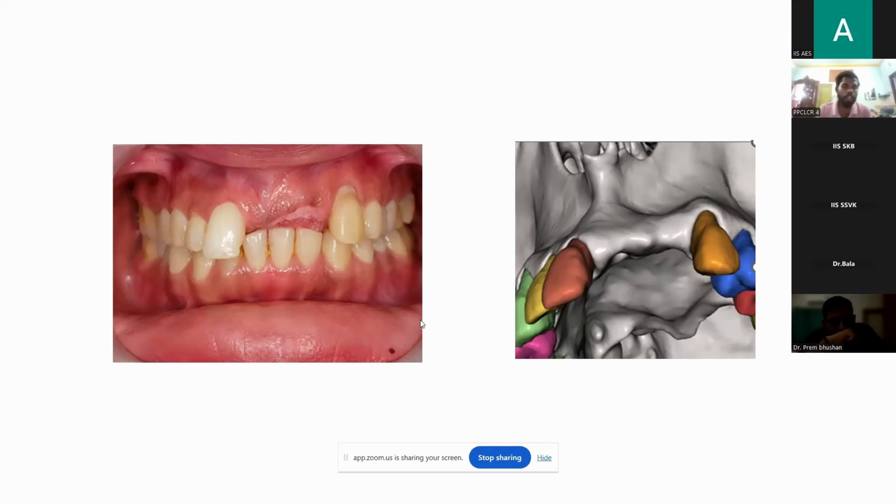Good evening, all. This case presented with three converging challenges: missing tooth, horizontal ridge deficiency, and high aesthetic demand. Let me start with asking a question: can implants be placed in this site without augmentation? If done so, it will result in compromised aesthetics and function. So this type of case needs horizontal ridge augmentation, as a first line for achieving proper contour, function and aesthetics.